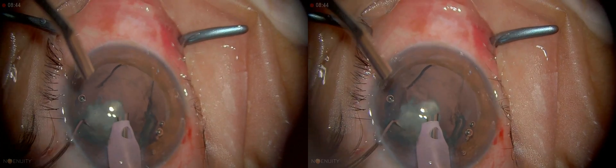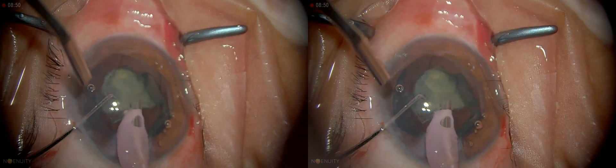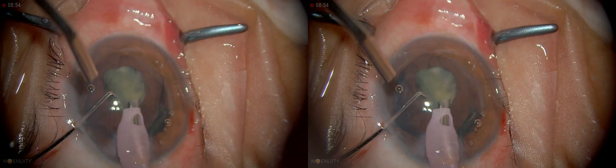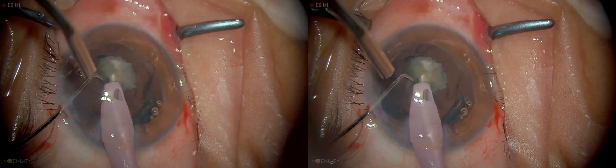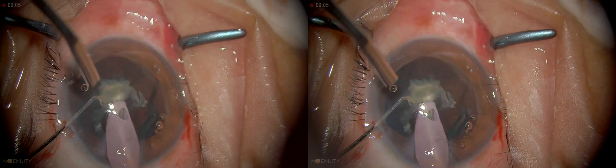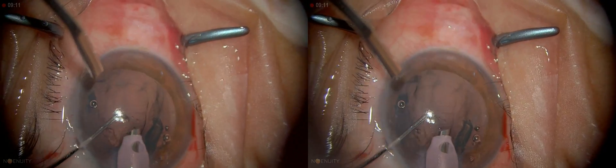And this is the last part. At this point either I can switch to a lower mode or just continue, but I need to be very watchful because this is the last quadrant. This is the time the posterior capsule can come up. So as I do this, I sort of take my foot off the pedal so that there is no instability of the anterior chamber at all.